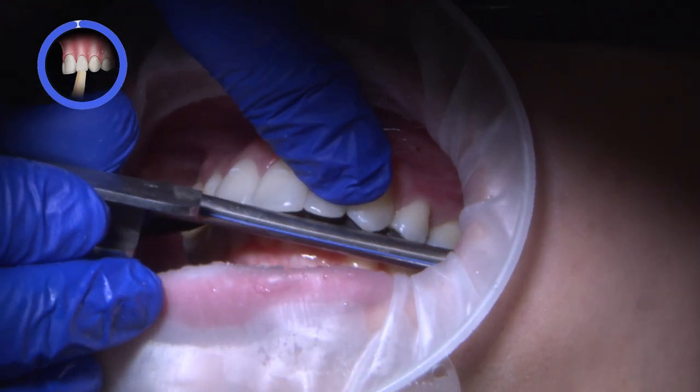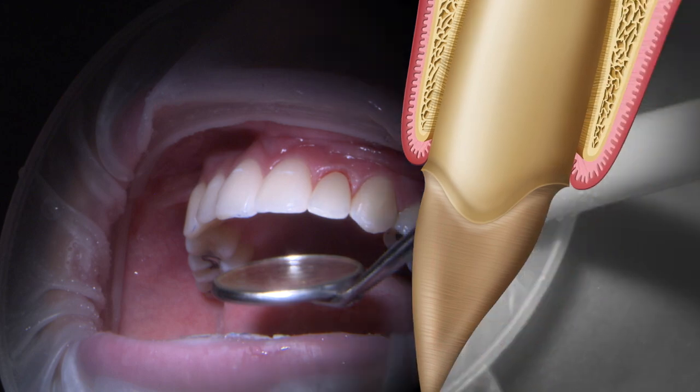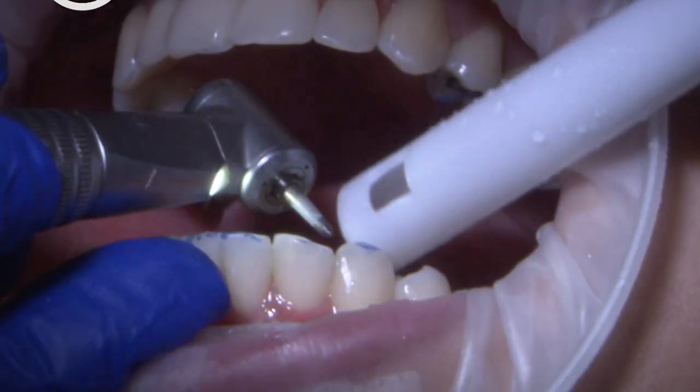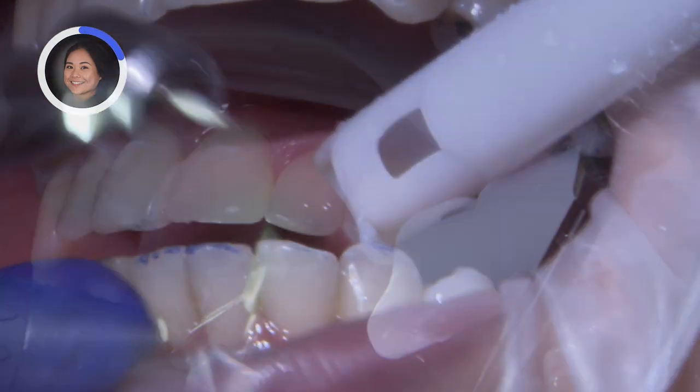I always re-check occlusion afterwards for hyper-occlusion after cementation. On a lower arch, I performed enamelplasty on teeth number 22 through 27, contouring the teeth to a natural, more even state.